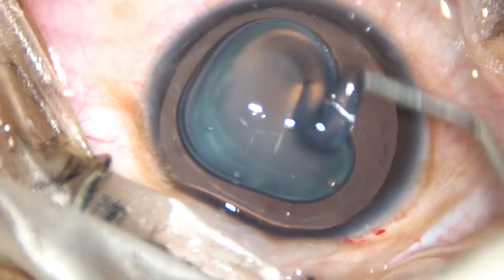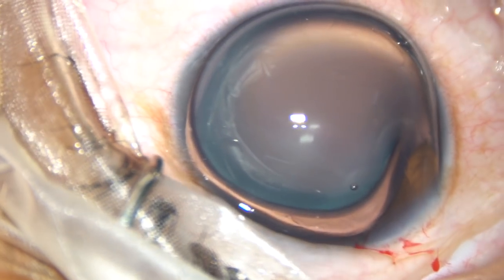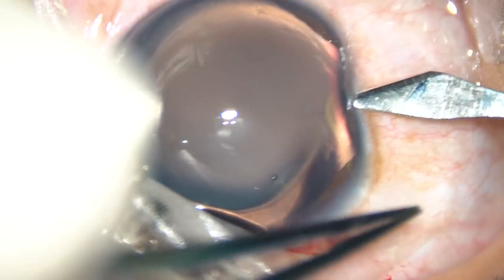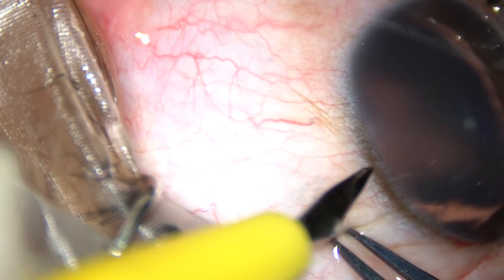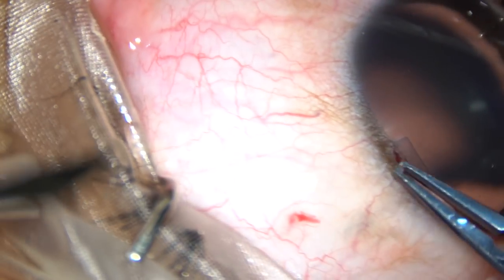Viscoelastic substance has been injected. Visco is applied with the corneal epithelium and now two paracenteses. This is a paracentesis on the right side of the main incision, and this is another paracentesis on the left side of the main incision.